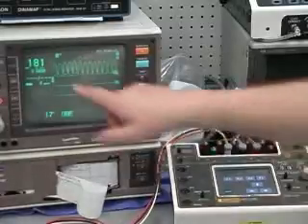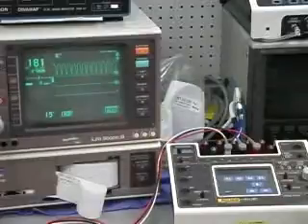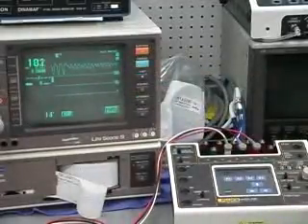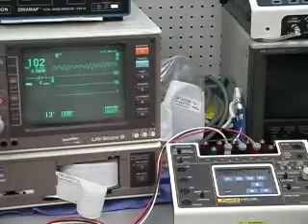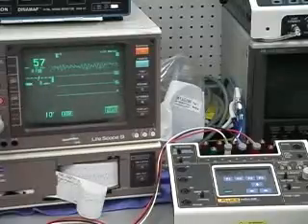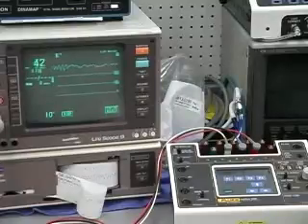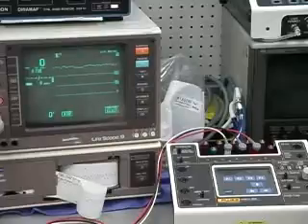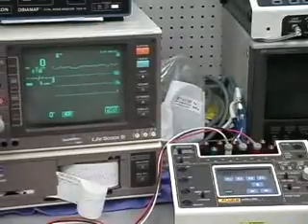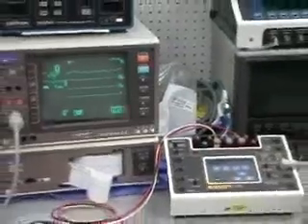Right on the... That's good, ventricular tachycardia. This goes and degrades to VFib. Oh, there you go, VFib. And then it degrades down to asystole. So by now somebody should have thought about it. Now they do one more withdrawal from his Visa card and send him out the back.